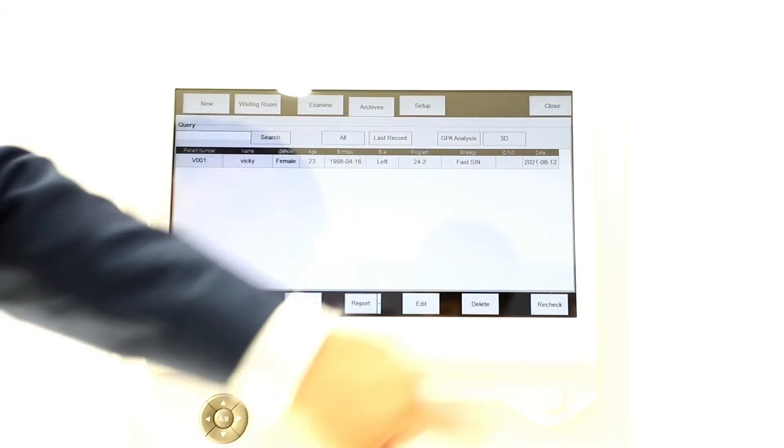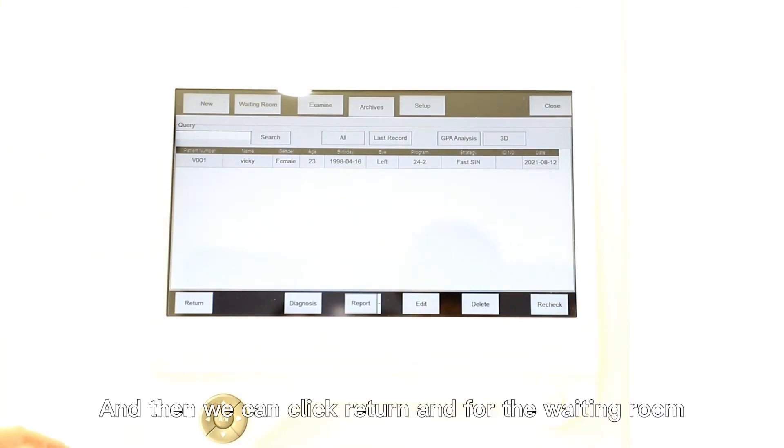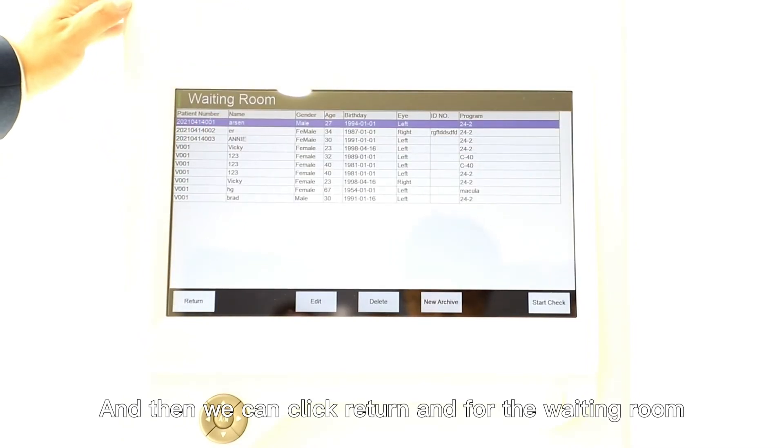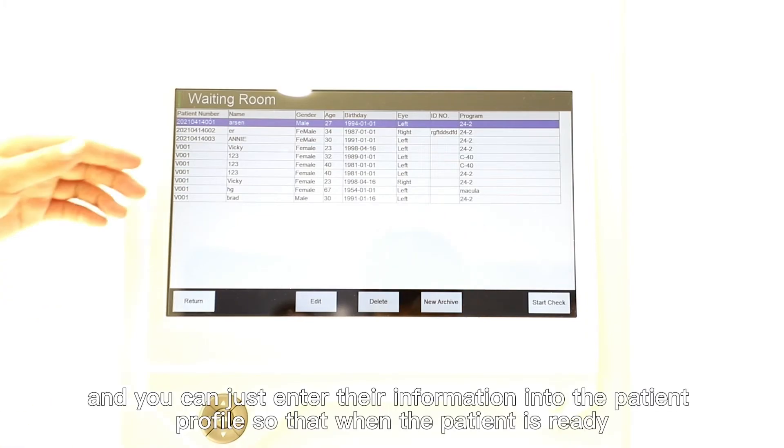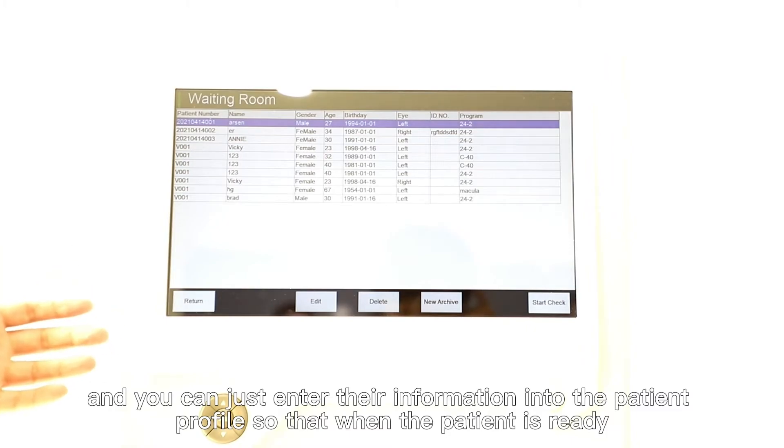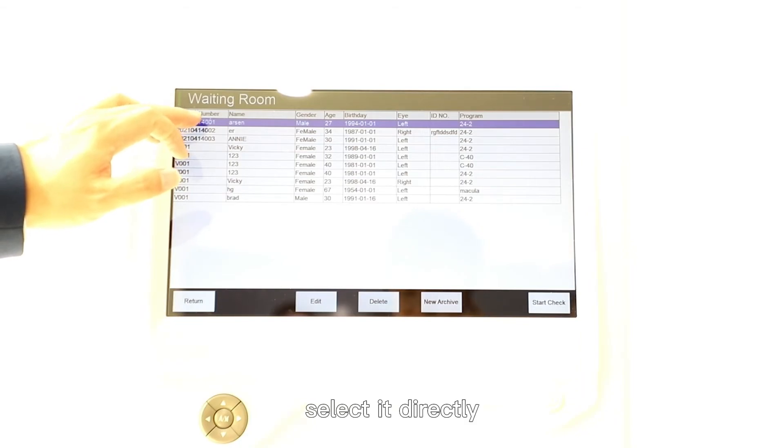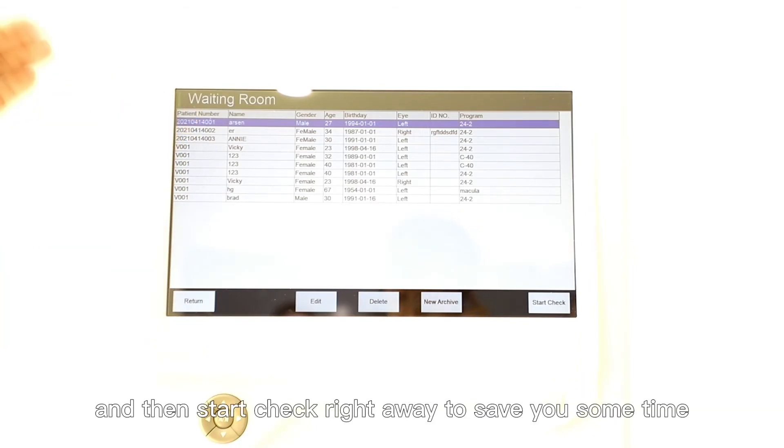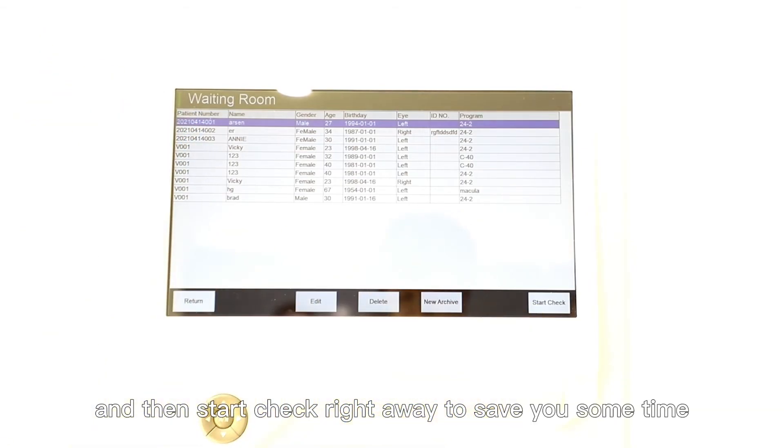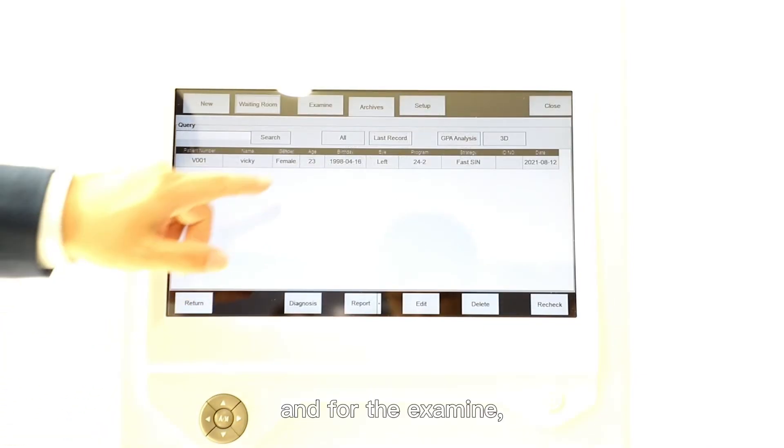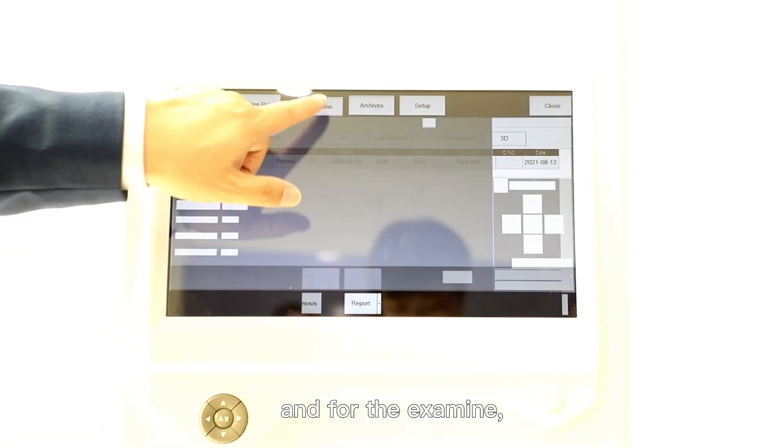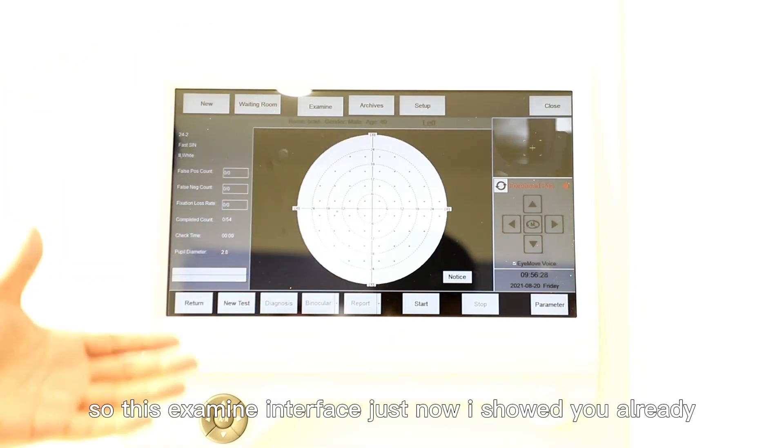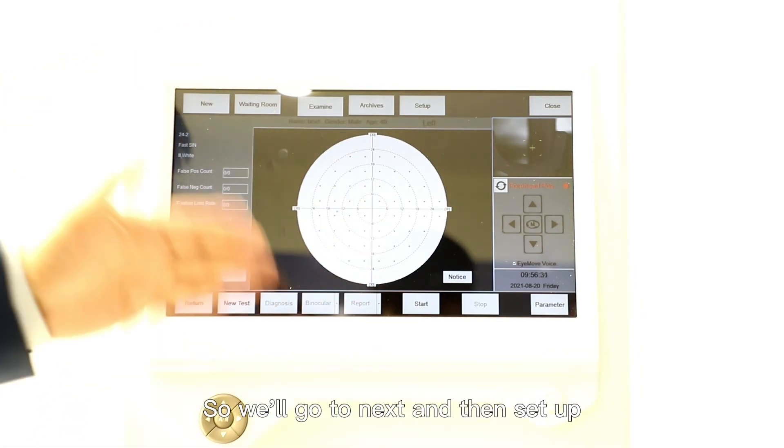Then we can click Return. For the waiting room, if there are many people lining up to do the test today, you can enter their information into the patient profile. So when the patient is ready you can select it directly and then start check right away to save you some time. For the Examine interface, I showed you already, so we go to next.